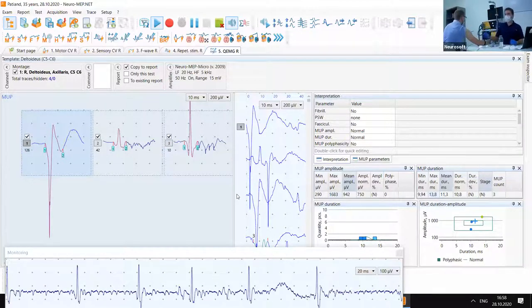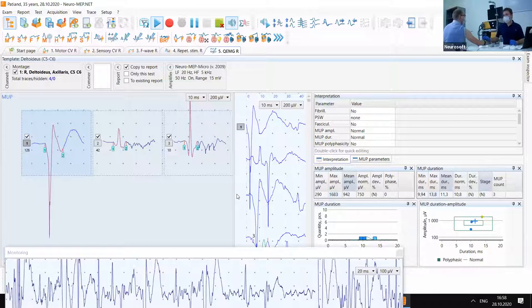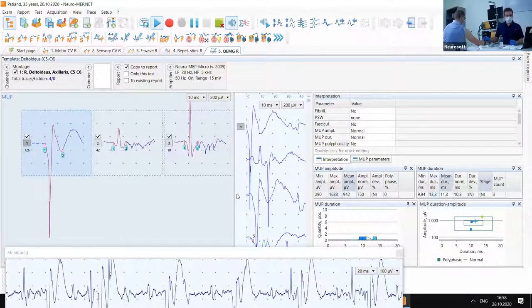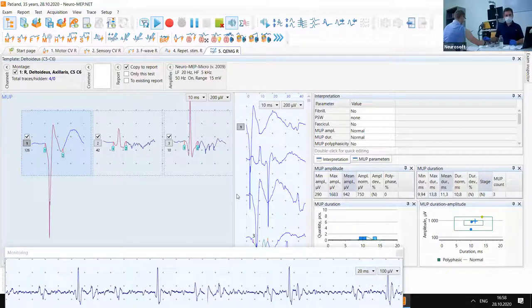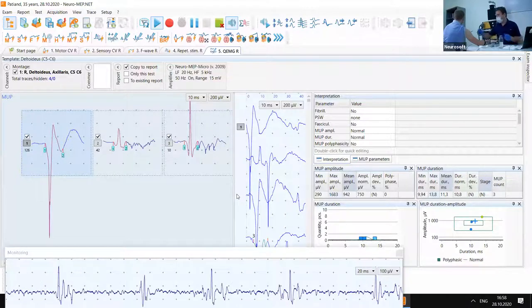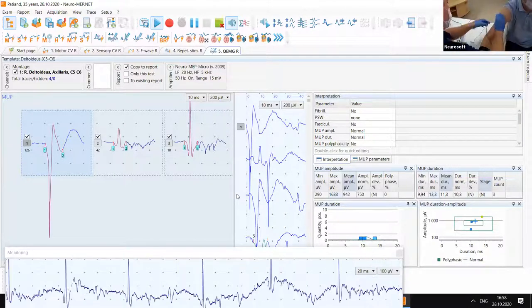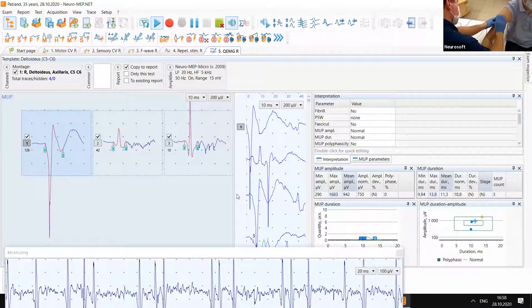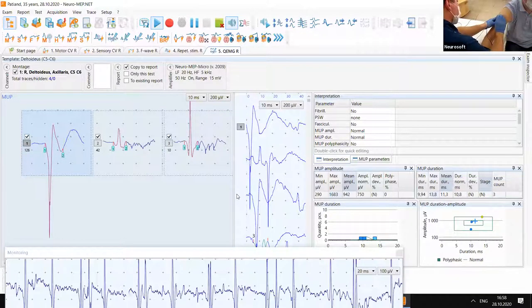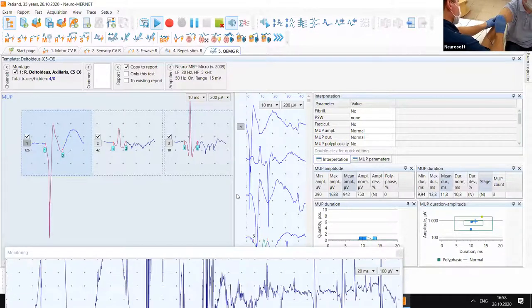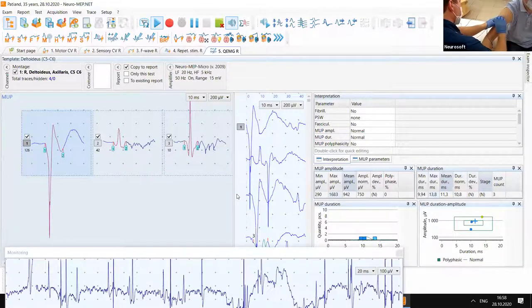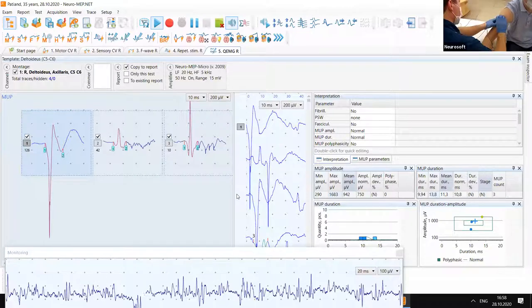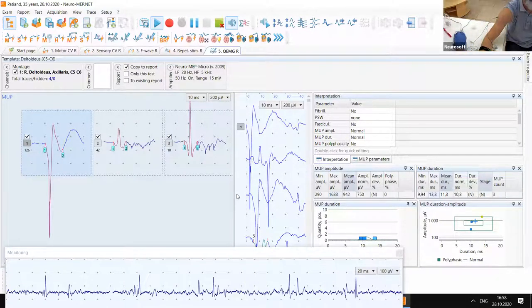A concentric needle registers about one millimeter normally. So usually we need to use five millimeter distance. We leave the needle in the muscle but change direction a little bit.